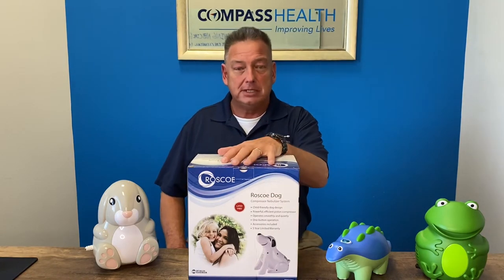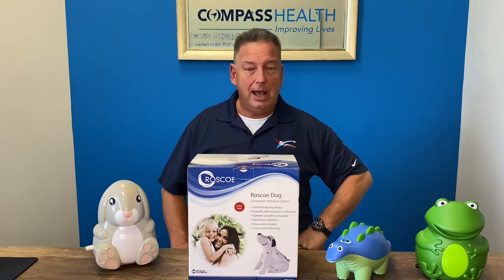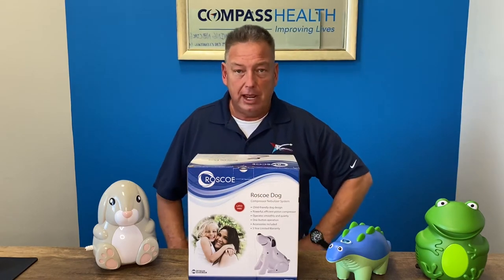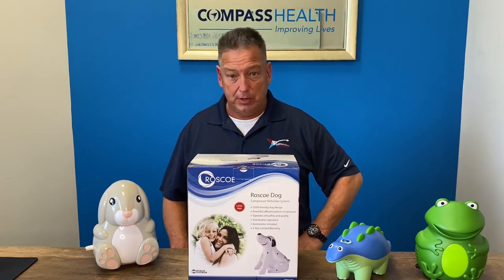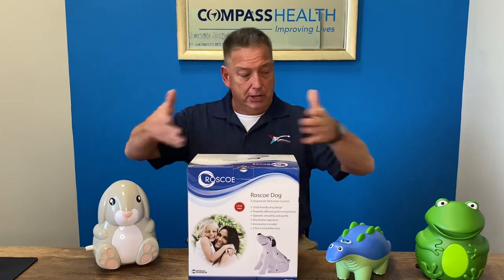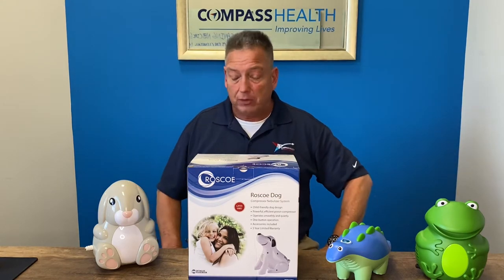The animal designs have been proven to show higher levels of compliance and relaxation for children taking their nebulizer treatments. Here displayed in front of me are some of the various models that Roscoe Medical offers.